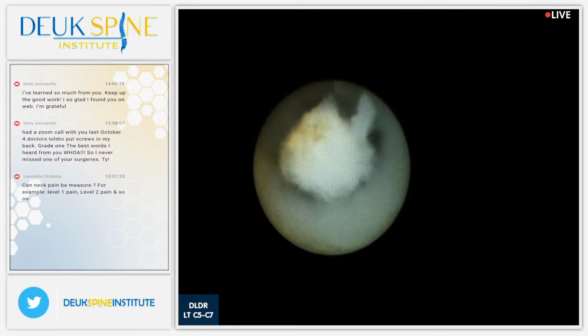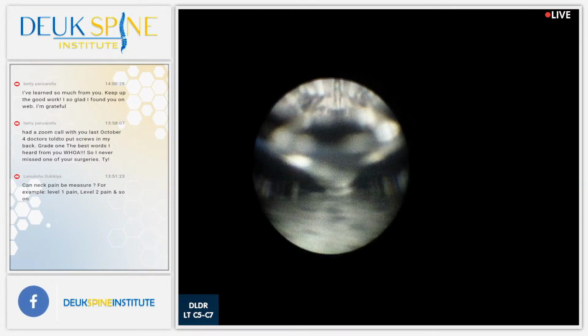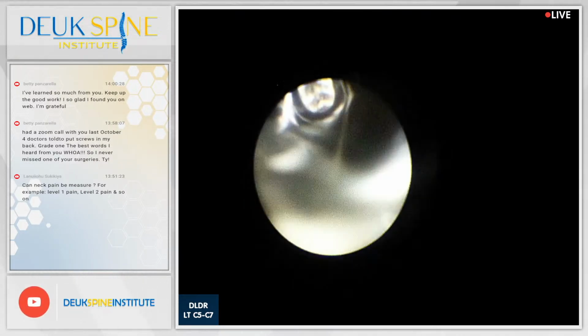Oh, wow, look at that piece right there. You guys see that herniation that just popped around the corner? Damn, yes, we do. Too big to fit. I've got to grab it and pull it. All right, almost done here. By the way, we've lost about maybe 20 drops of blood. We had a little bit coming out when I switched levels, but for the most part, that's it, guys.